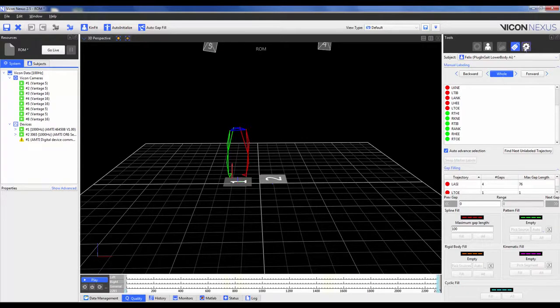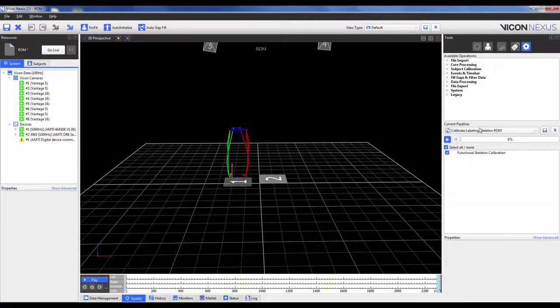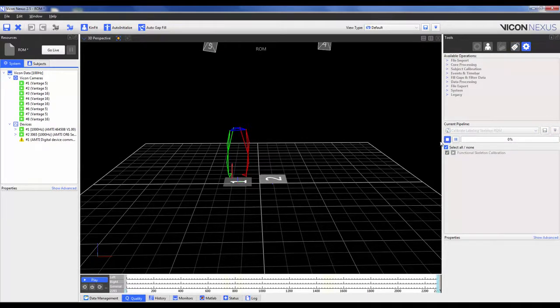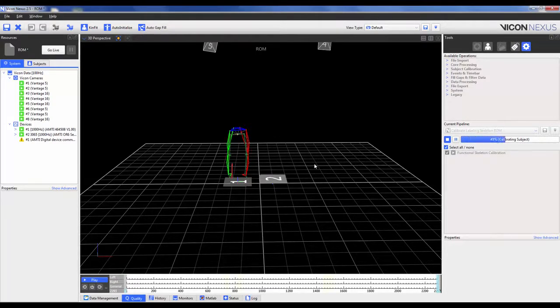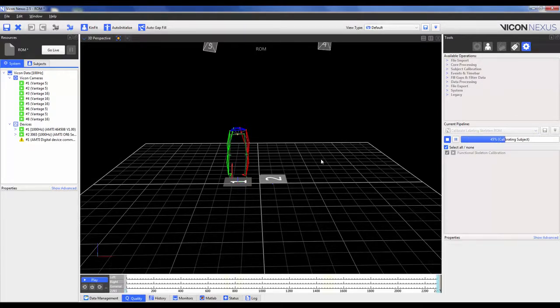As we don't have to do that, we can just go ahead and run the Calibrate Labeling Skeleton ROM Pipeline. As this pipeline can take a bit of time to calculate, we want to make sure that we develop a quick set of reasonable movements so that it has less frames to use as part of its calculation.